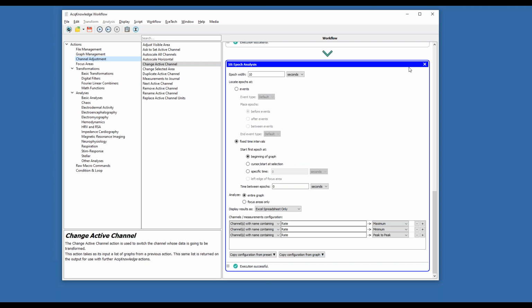Now, one thing that I always like to point out, BioPac doesn't sell black boxes, and this is not intended to create a black box system. When you're preparing your data for analysis, you really need to make sure that the data is good, it's clean, you've got sensible physiological values for the participant.